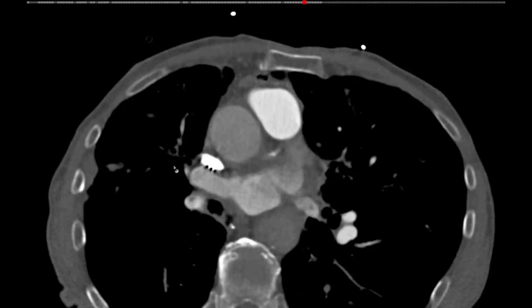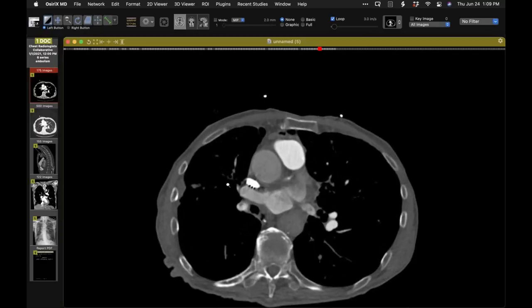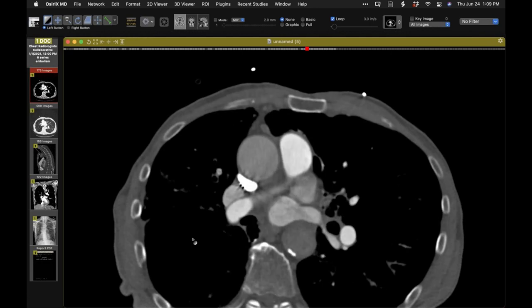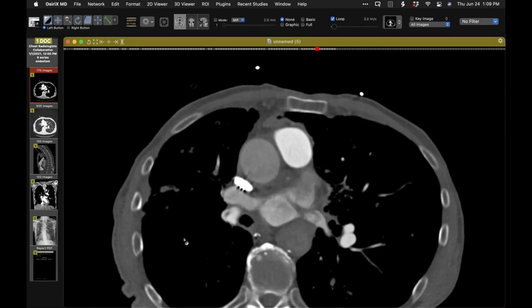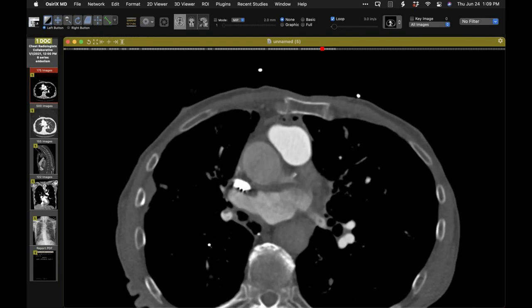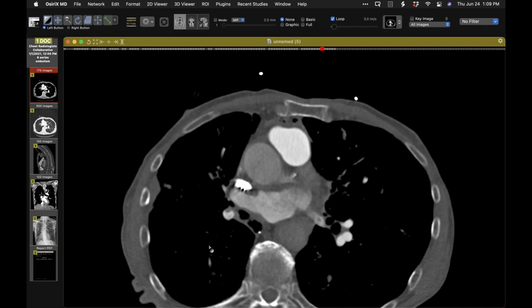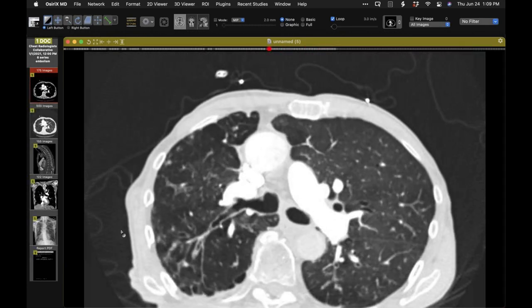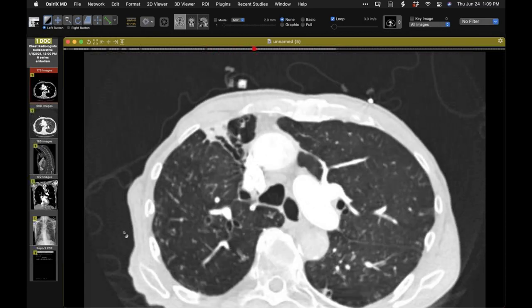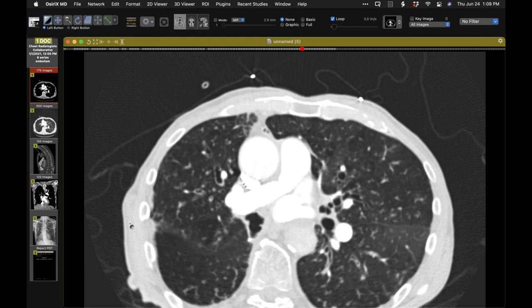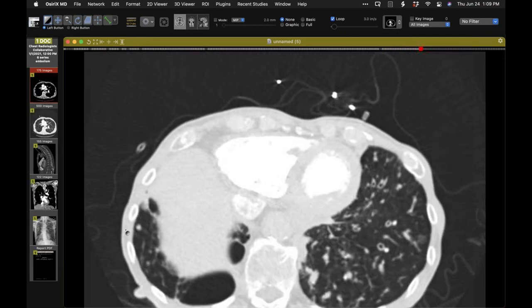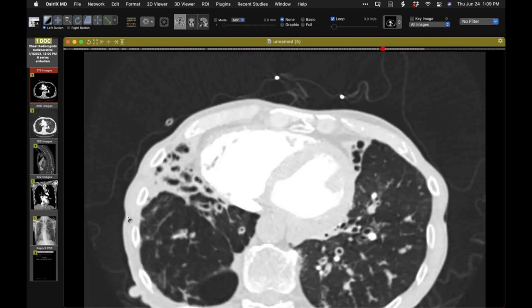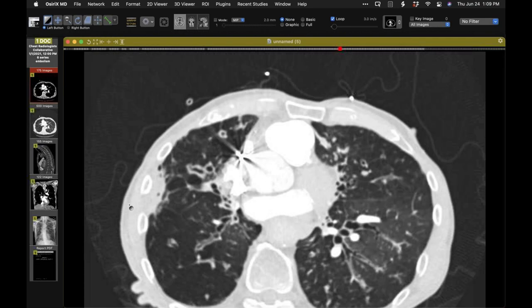The attenuation values here are not consistent with acute PE. So what about the context - why might we have blood flow from a bronchial artery to a pulmonary artery in this patient? This patient has very chronic and very extensive airway disease and bronchiectasis - certainly a context in which one can have hypertrophied bronchial arteries. We know communications can occur between bronchial arteries and pulmonary arteries not only in severe and chronic airway disease, but also in fibrosing lung disorders that are chronic as well.